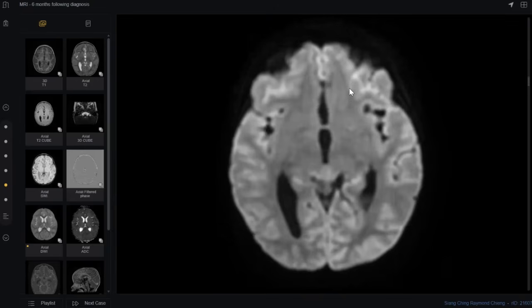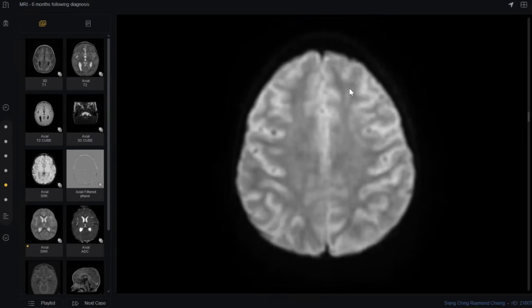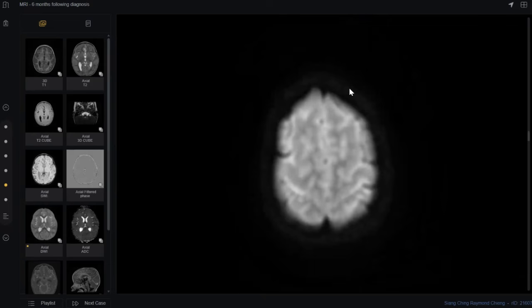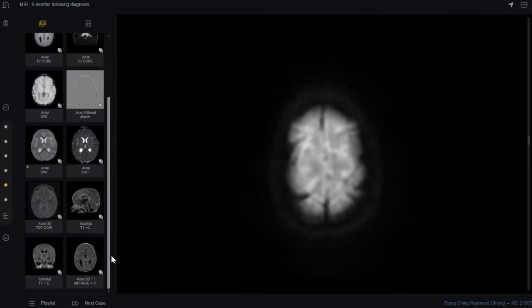What does it mean for you? Bilateral cerebral hemispheres. What does it mean for you? There may be some metastasis going on in the head. Which type of metastasis? Leptomeningeal metastasis. Excellent. What is your next step? I would like to confirm it on the post-contrast sequence.